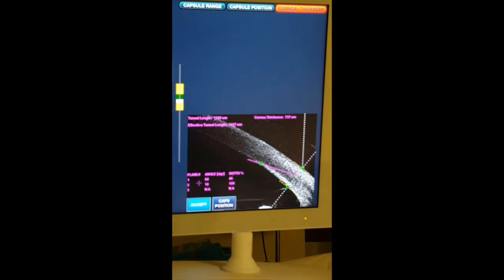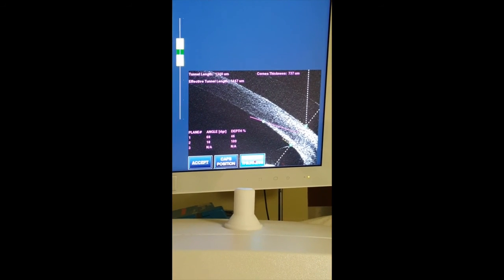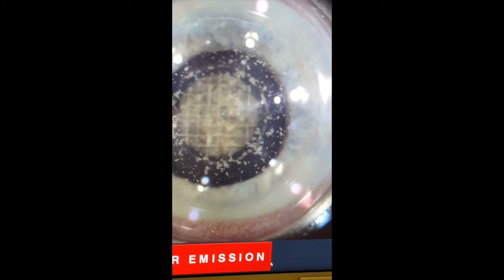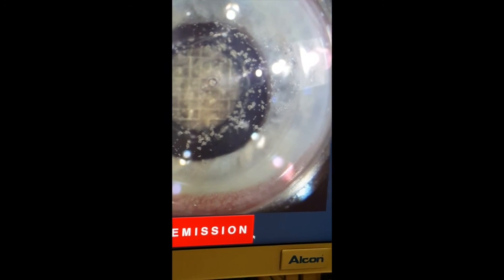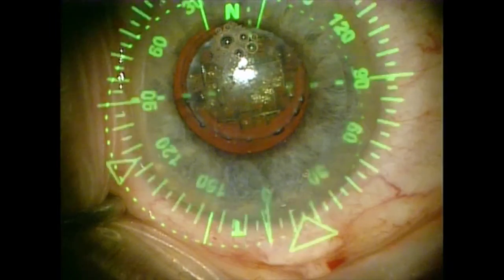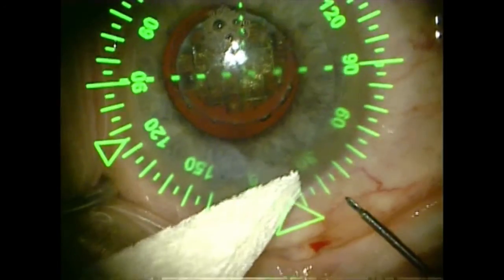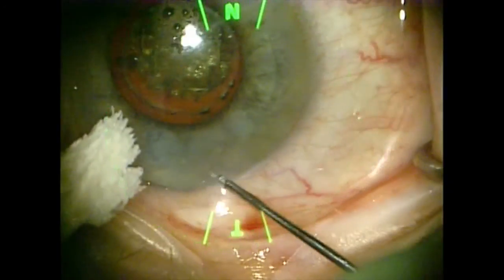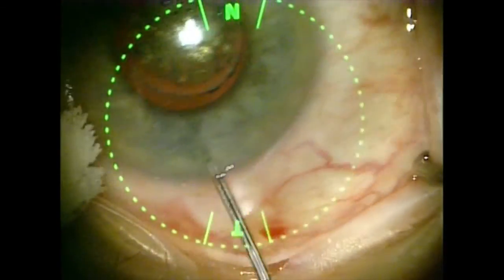and show an additional cross section of the cornea here. And it looks to be at that time that center is starting to become white there, so I accepted that. And here's the video of the laser and the surgical correlation here. It's in a very good position, maybe 1 millimeter anterior to the limbus. Could have been maybe 1 millimeter a little bit more posteriorly, but still in a very good location.